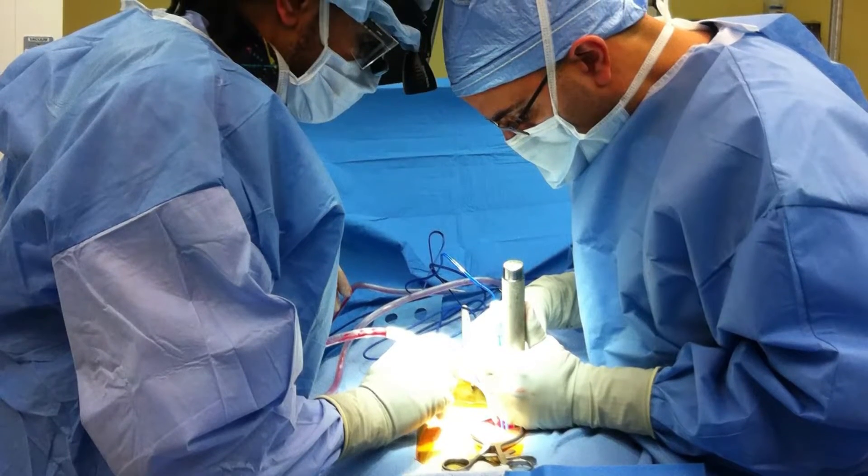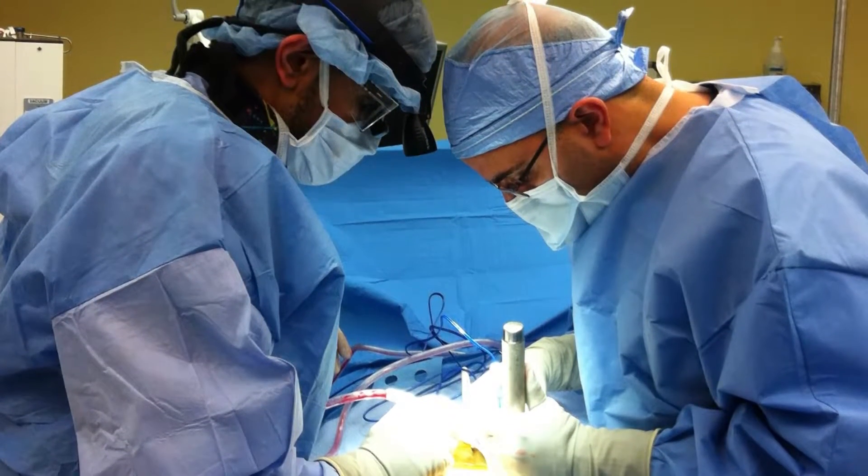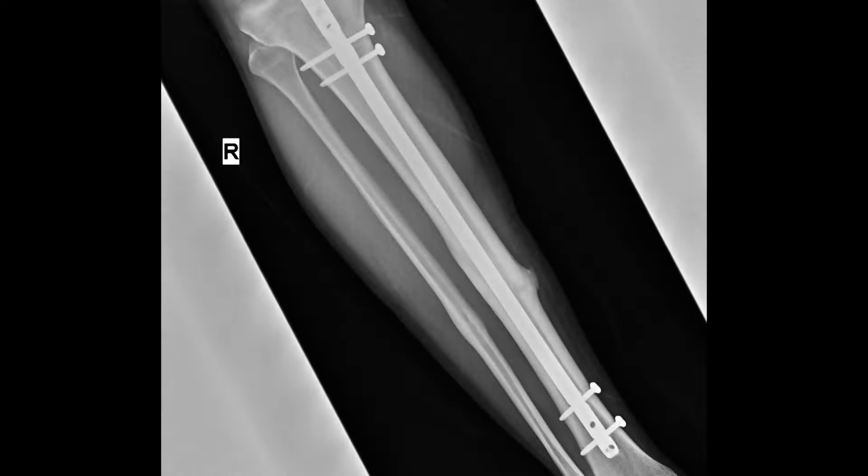As I'm taking these multiple x-rays, the pressure is mounting. It exposes patients and staff to more radiation. And then there's the risk of missing. I was just like, well, there needs to be a better way to do this.